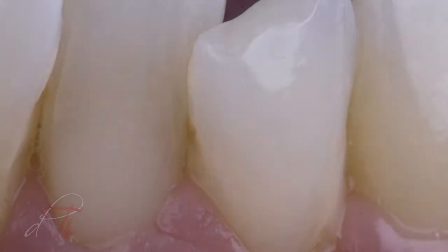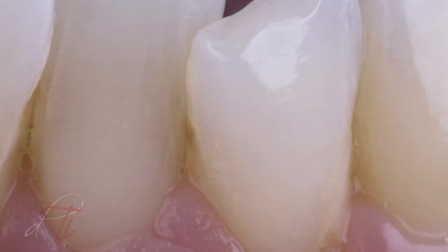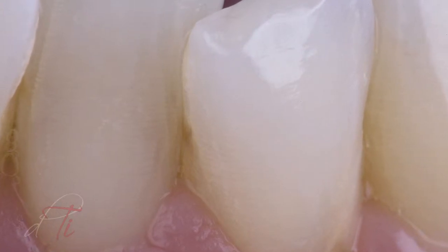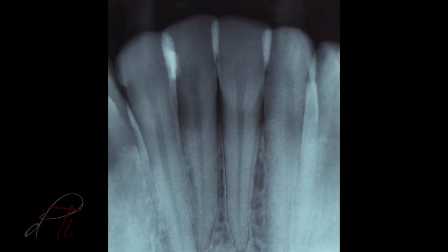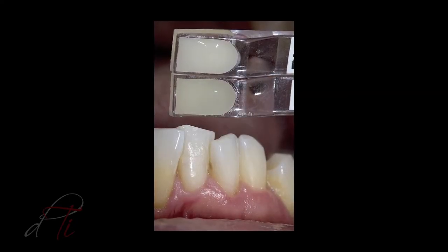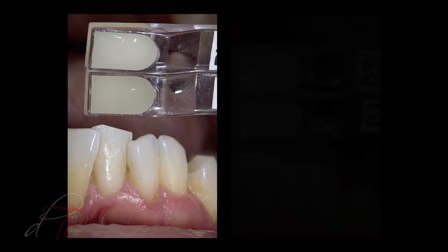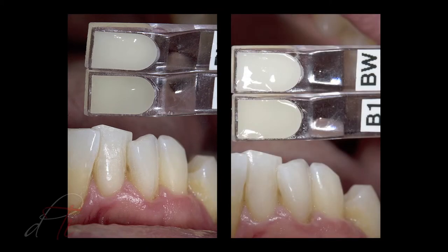The patient presents with interproximal caries on the mesial aspect of the mandibular left lateral incisor. After radiographic evaluation, a shade comparison and determination was performed prior to the restorative procedure. The dehydration of the tooth from water molecules being depleted from the enamel rods can result in improper shade matching.